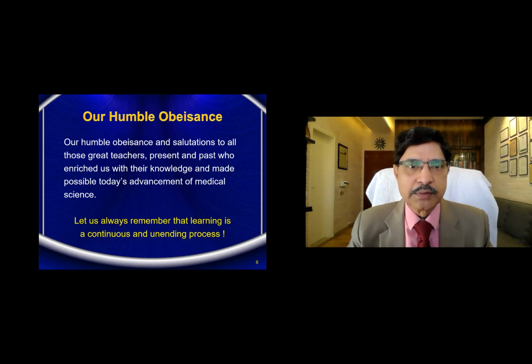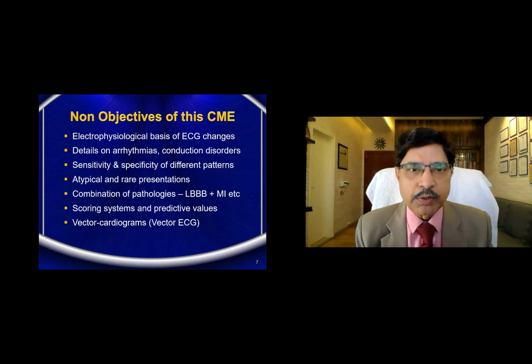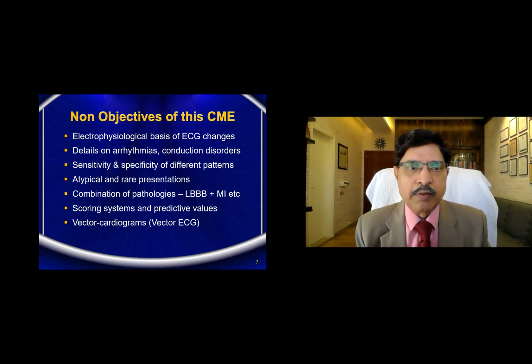My humble obeisance. The non-objectives of the CME are: we are not going to discuss the electrophysiological basis in depth about each waveform. And of course, the details of arrhythmias are out of scope of a workshop. One can do a separate workshop on arrhythmias itself. Nonetheless, I will give you some idea about how to diagnose common arrhythmias and conduction disorders. ECG is a diagnostic test, but we are not going to evaluate the sensitivity and specificity of ST segment elevation or presence of Q wave and things like that. That is a little beyond the scope of our workshop.